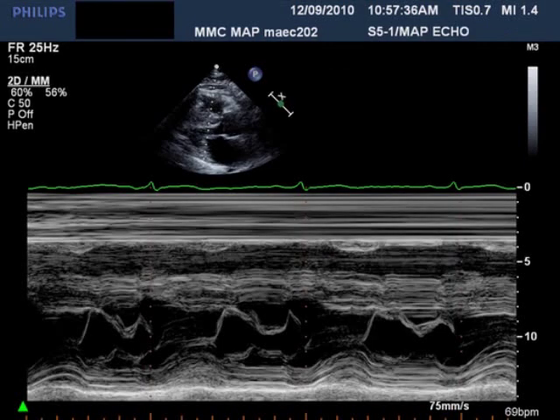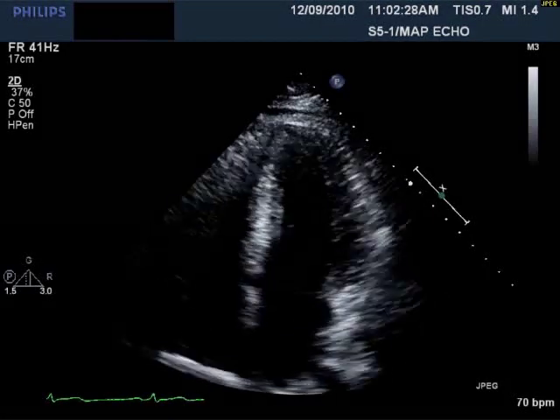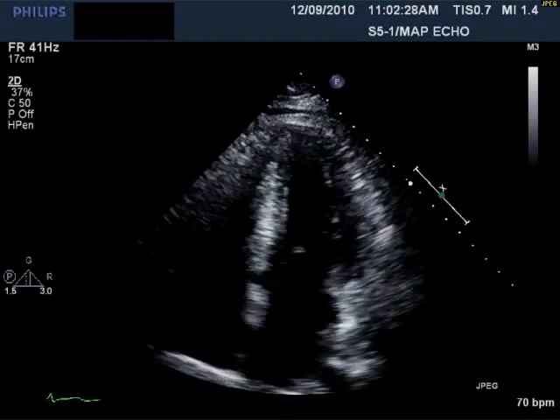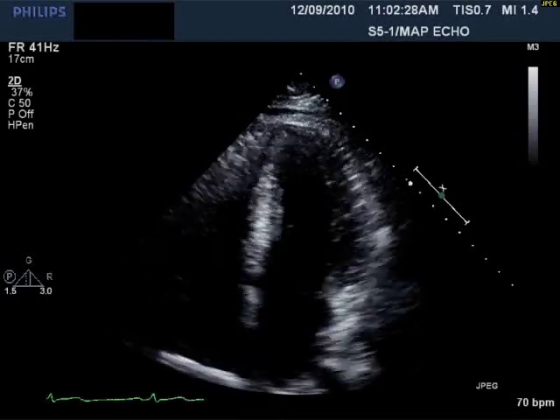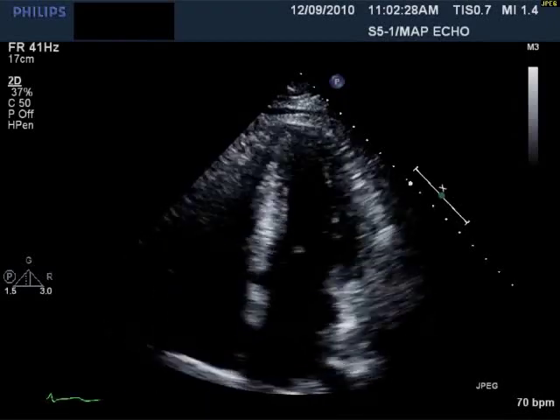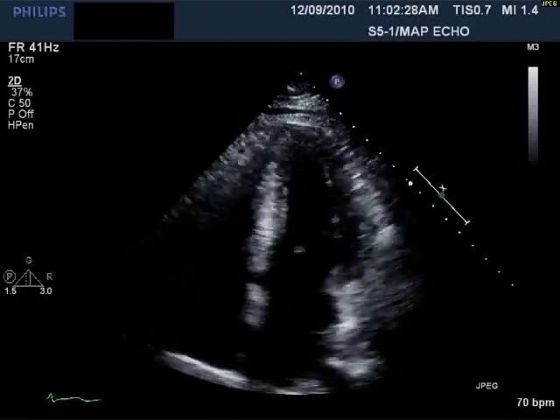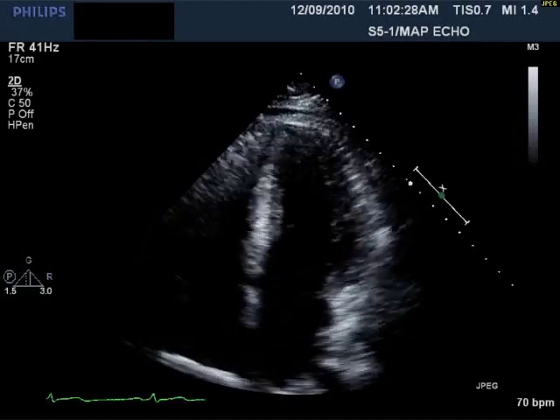I've also provided an M-mode through the mitral valve, which you can look at. Here are a few more images from his transthoracic echocardiogram — the apical 4-chamber view. Take a look.